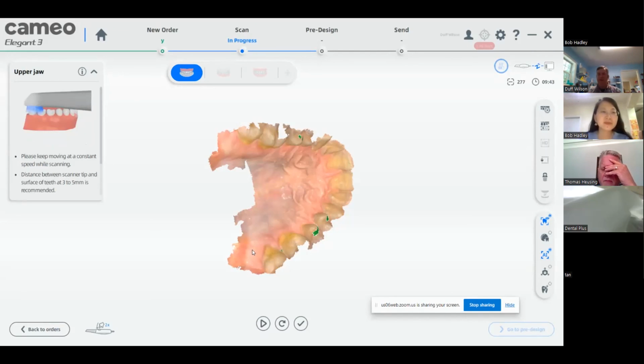Gotcha. So for right now, Fiona, as we know, for the scanner and the US market, I would be most of your tech support for it. I love talking to people, and it's an area that we're going to be growing in, tech support on the software issues.